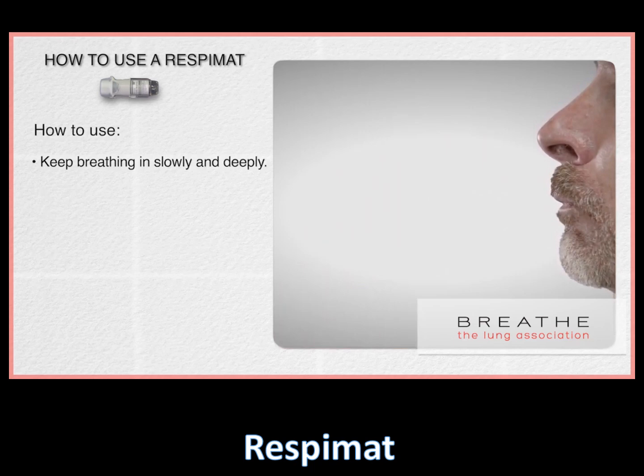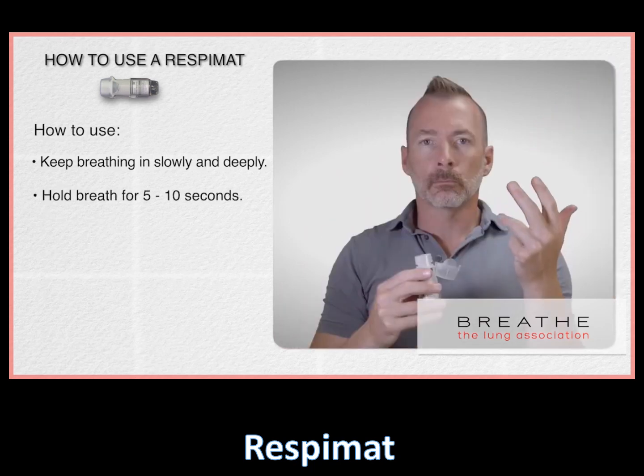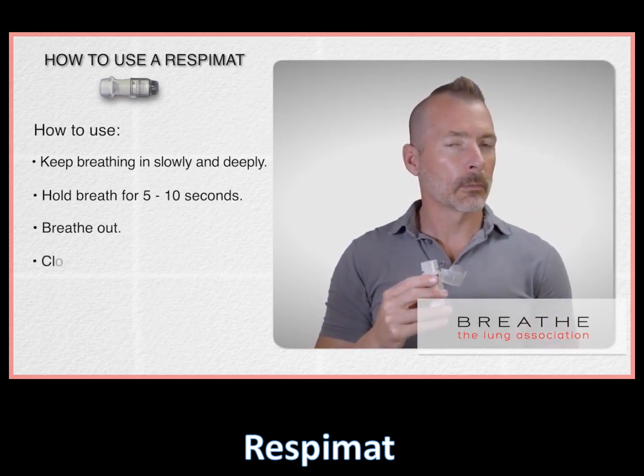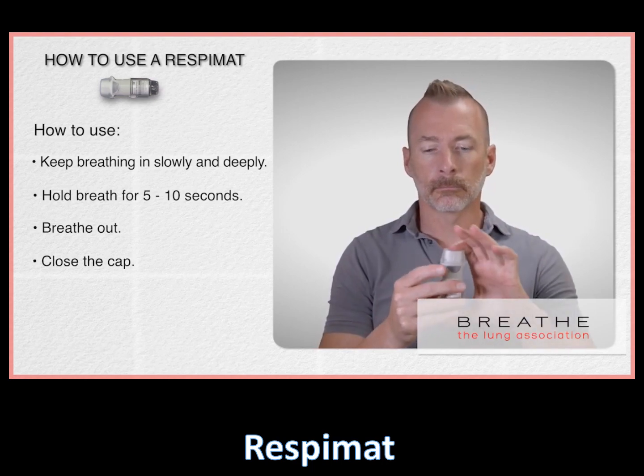Remove the inhaler from your mouth and hold your breath for 5 to 10 seconds. Breathe out. Close the cap, and if another dose is required, repeat these steps.